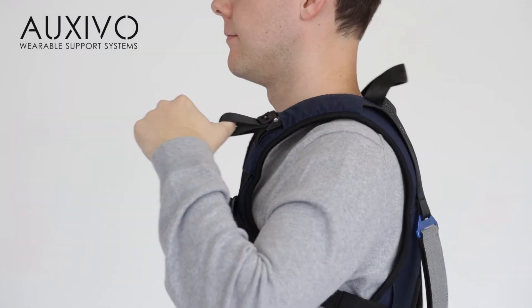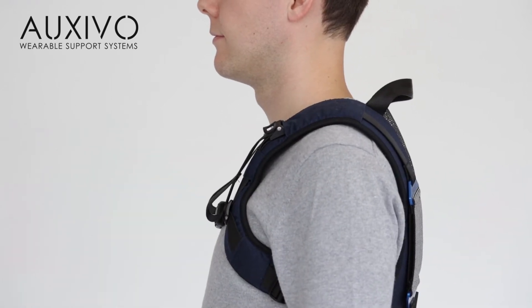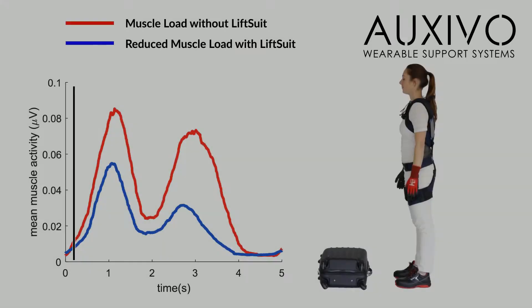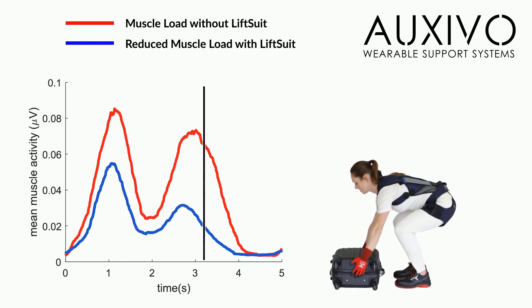Each time before you start working, activate the lift suit by pulling the activation straps on top of your shoulders. This will tension the elastic elements so that they support your back and hips when lifting and leaning. When it is activated, it will support you during every lift.